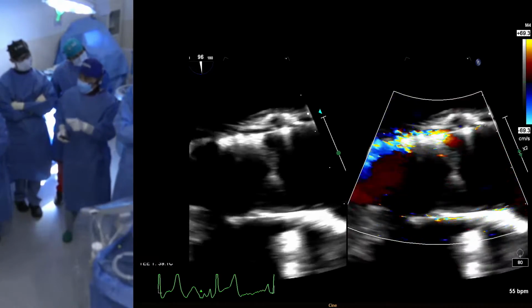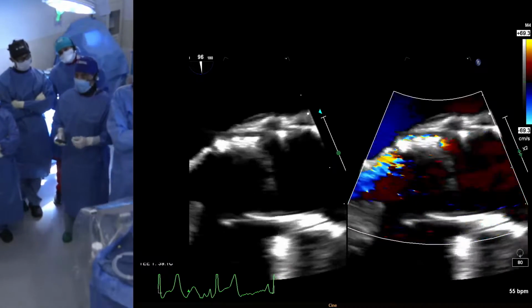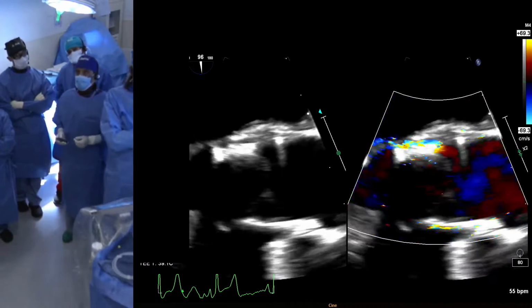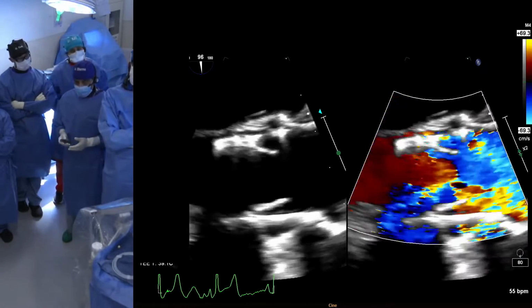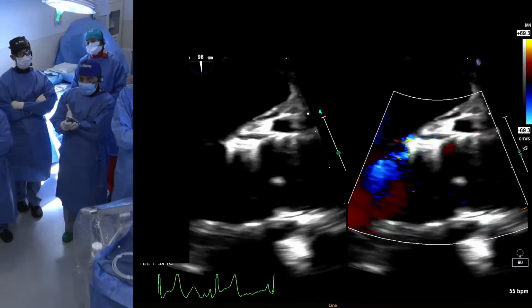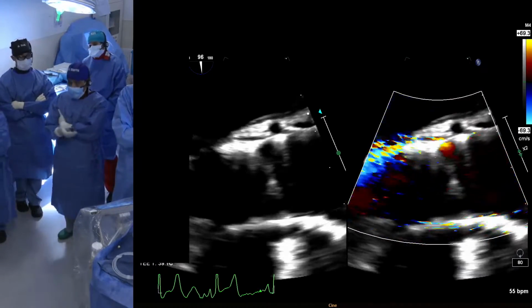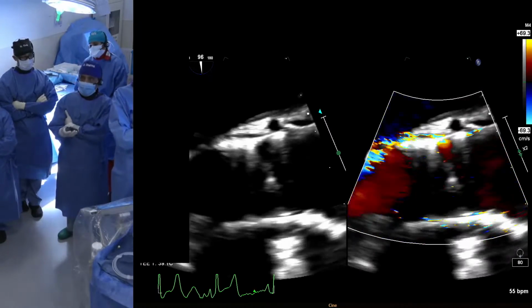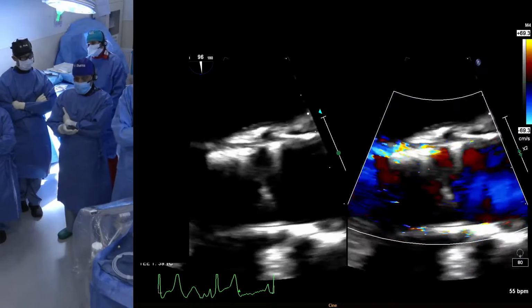Yes, yes. That's why we have done some cases of this, whether self-expanding or balloon-expanding, just doing a BAV and decreasing it. In this particular case, we all felt that balloon dilatation alone will not be enough. It may decrease it, but we don't want to go to the same situation this patient had: mild at baseline and back in 15 months. So here we have to come out with almost no PVL or trace.